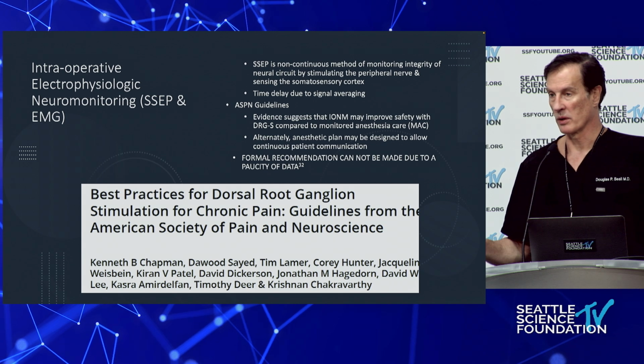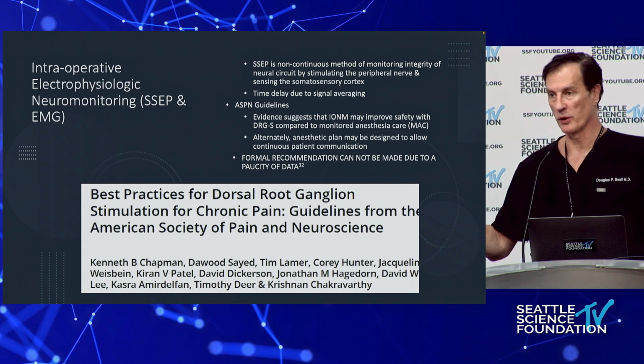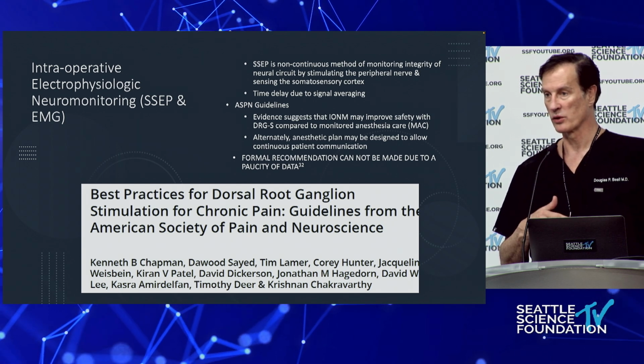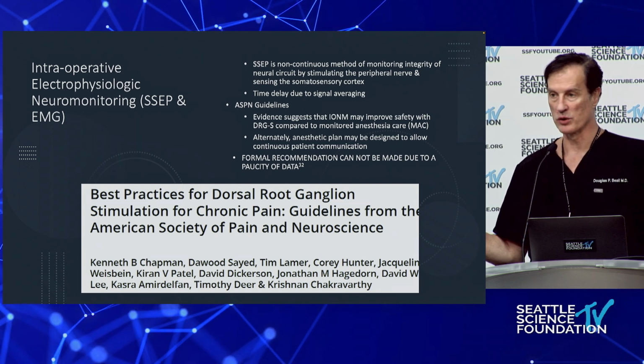It's really piecemeal: for foot pain, for groin pain, for a single swath of territory, a left knee, DRG is ideal. It's really hard to get just isolated feet with spinal cord stimulation if it's not something like painful diabetic neuropathy. With PDN, it's very good. I mean, we're able to get 80 for 80: 80% of people get 80% reduction in pain, and this is something we can actually believe. I see this clinically all the time. But to divide it into body parts, if you were to have an isolated body part, DRG is great.